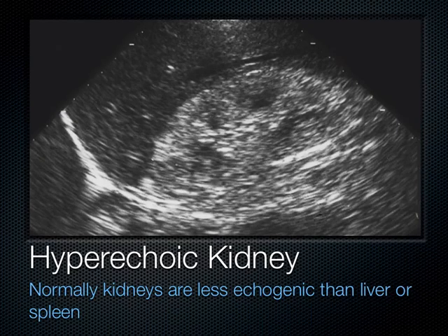Now moving on to the abdomen, there are lots of ways we can diagnose infection in the abdomen. I'm going to start here with the genitourinary system, and we're going to talk about the kidney. Now, pyelonephritis, this is the kidney here. You're used to seeing it much less echogenic, but this is what a kidney looks like when it's infected or has pyelonephritis, which is normally a very clinical diagnosis. You pound on the patient's back, they've got some CVA tenderness, and pyelonephritis is diagnosed with that and an infected urine specimen. But here we see a kidney on ultrasound that looks very hyperechoic, and we see this commonly.